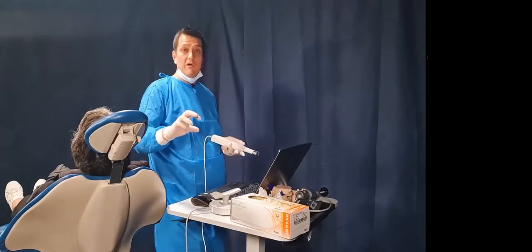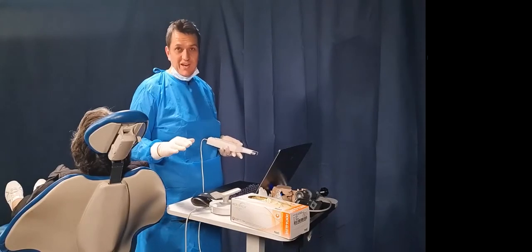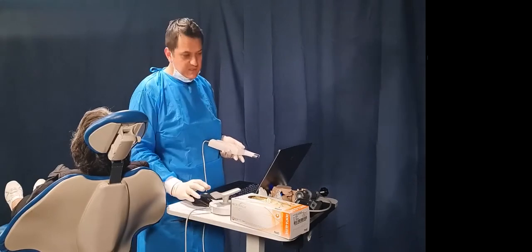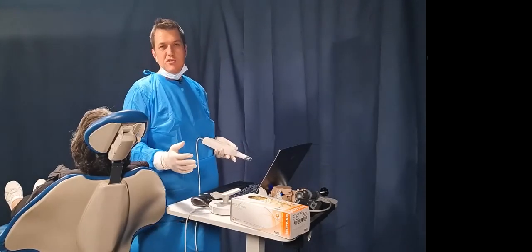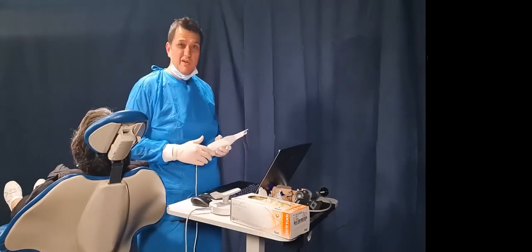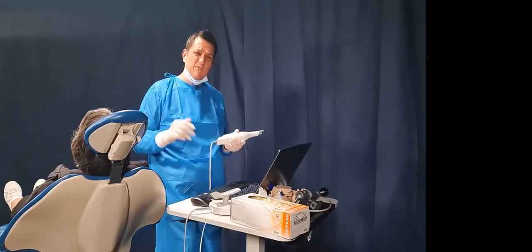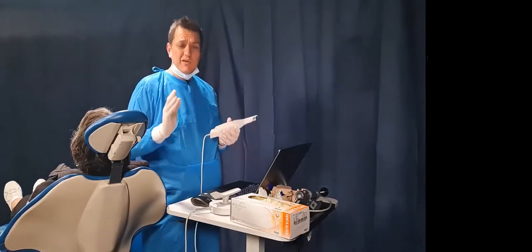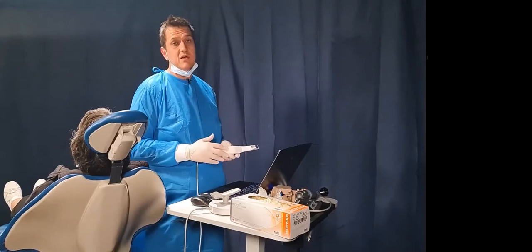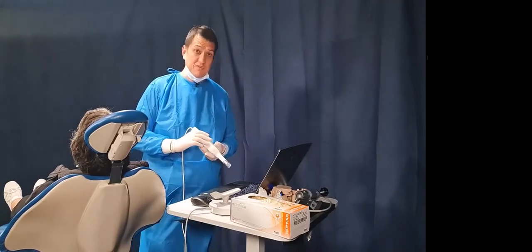Now the upper is a lot easier than the lower. Don't beat yourself up if you've got a very flat pancake upper with minimal bone, minimal rolling aspects, which is much easier to scan. You can't get them all. It might be 19 out of 20 you'll be able to do. There's that 1 out of 20 that you just won't be able to do, especially in the lowers when it's as flat as anything and there's saliva everywhere, tongue's going crazy. So don't beat yourself up. There is a place sometimes for the conventional, but you know what? This is amazing, and 19 out of 20 is not bad in my books anyway. So let's go and finish off the scan on the other side as well.